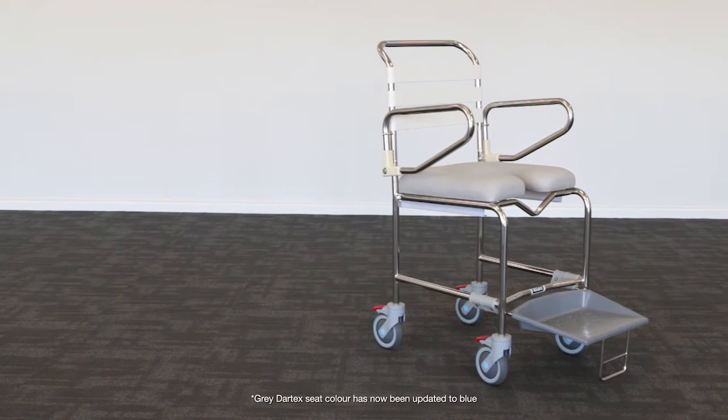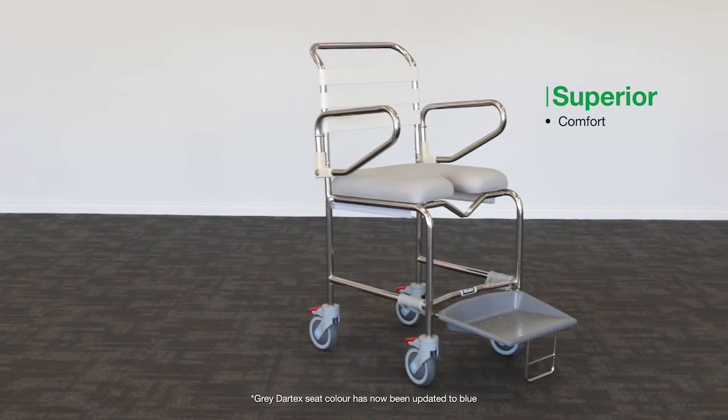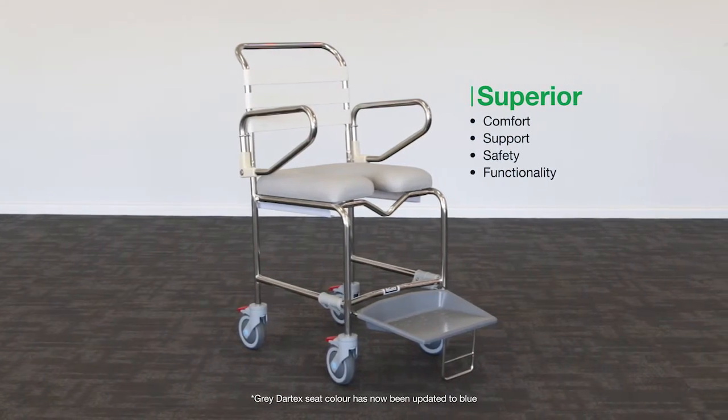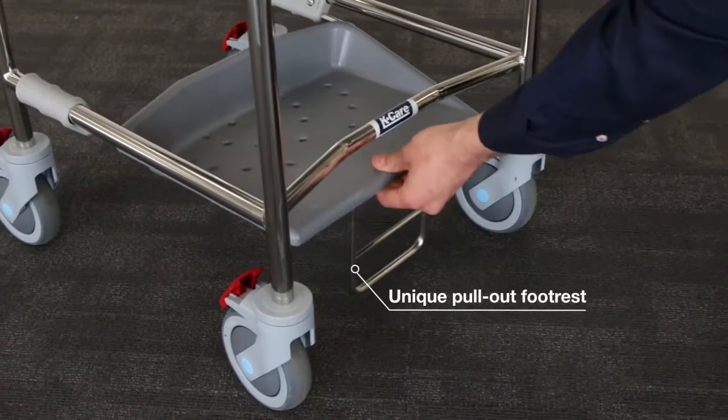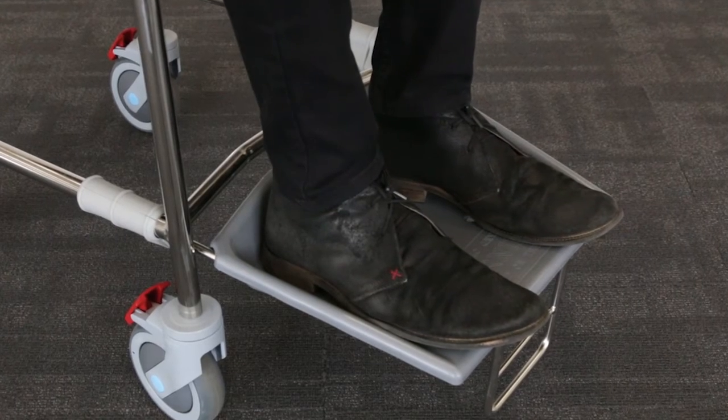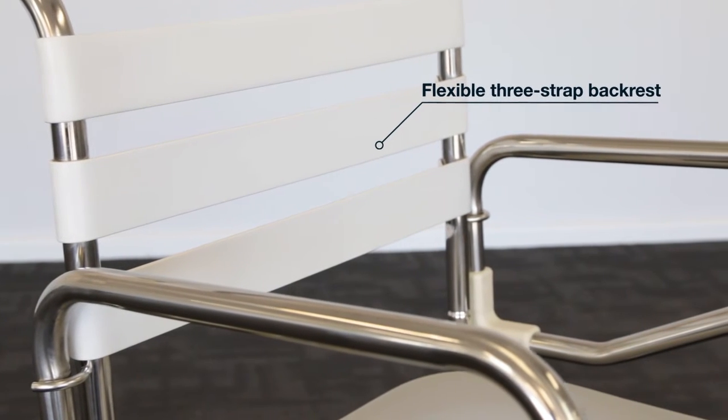The mobile shower commode range from K care delivers superior comfort, support, safety, and functionality. The sliding footplate model features a unique pullout footrest style allowing for unobtrusive transfers. A flexible three strap backrest allows for optimal water flow in the shower.